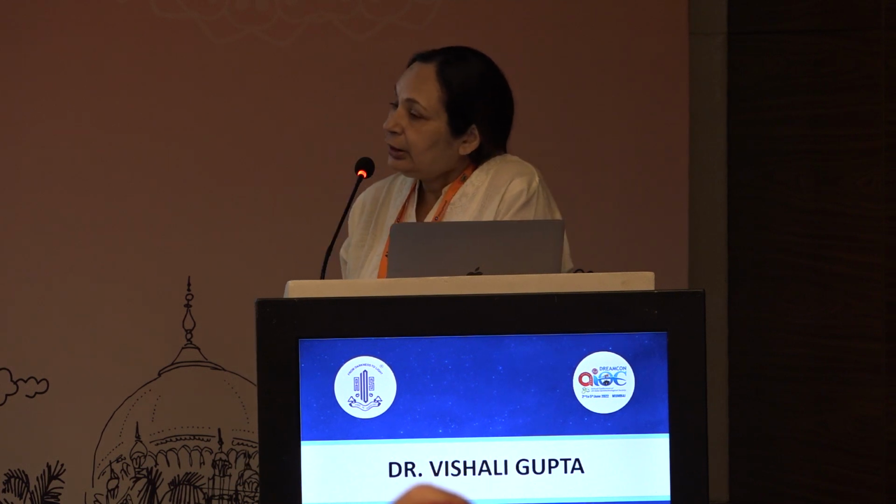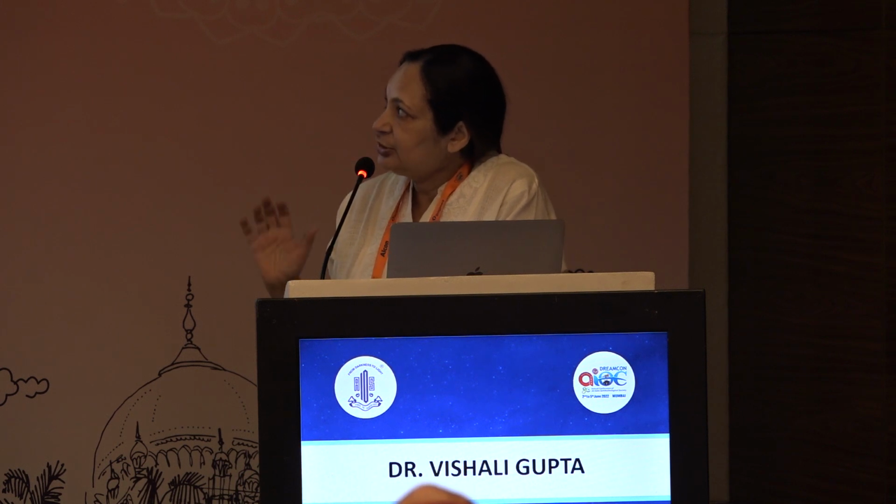So the purpose of this study was to compare multicolor scanning laser with the standard digital color photograph in posterior uveitis. It was done as a thesis of Kajri, who's here, and Anirudh and Kanika, and a lot of people were involved in it. We had 69 eyes of patients who came to us in different stages of posterior uveitis, both active and inactive. All underwent imaging on multicolor as well as the standard. The multicolor was Spectralis and the standard was our old Visupac Zeiss camera, the conventional one.